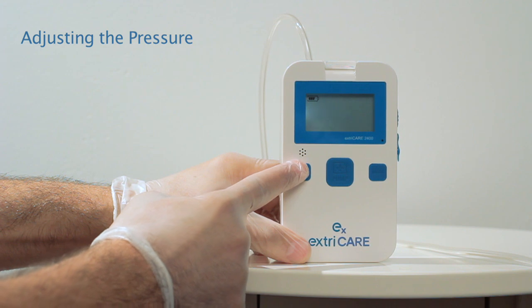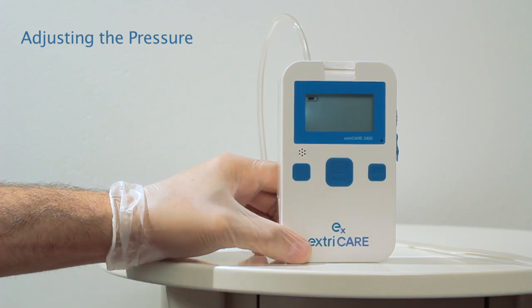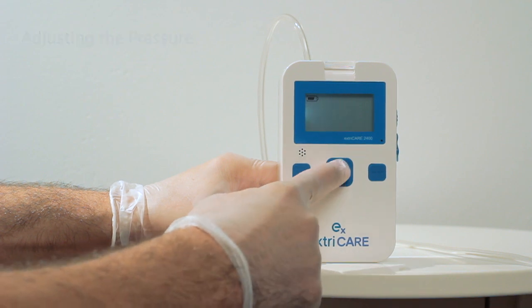The pressure can range from 40 millimeters of mercury to 140 millimeters of mercury. Once it cycles to the prescribed pressure, press the pump button to confirm.